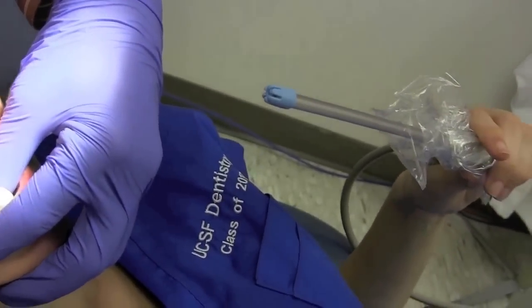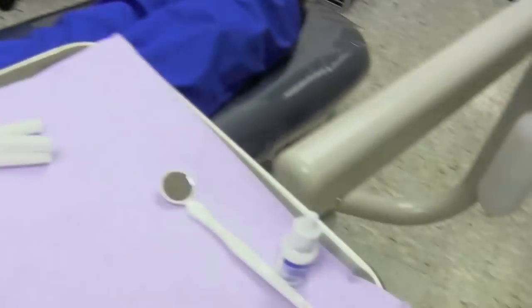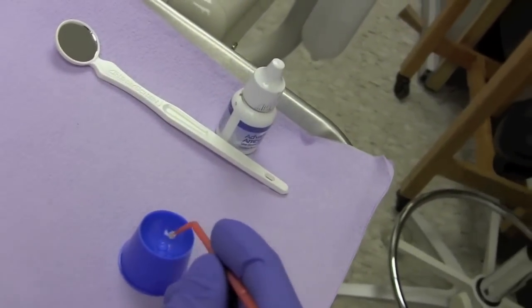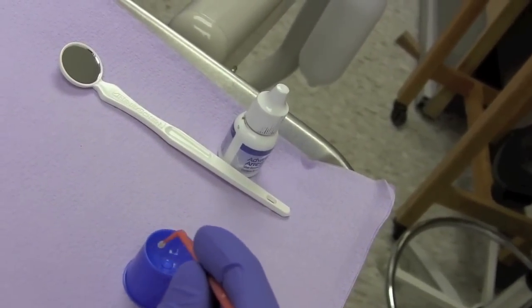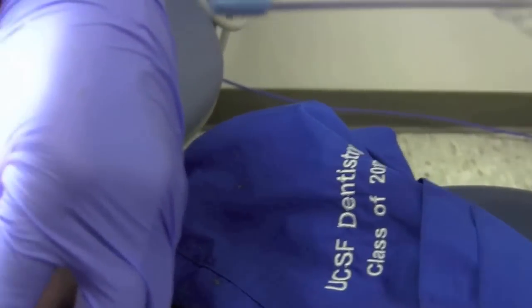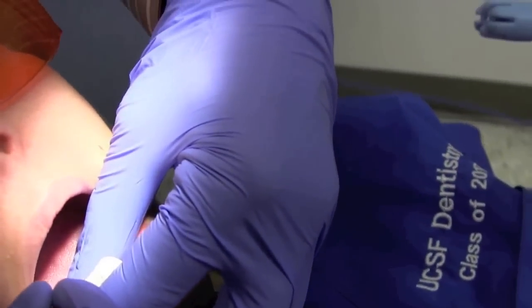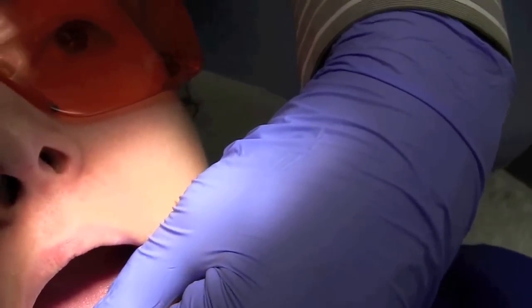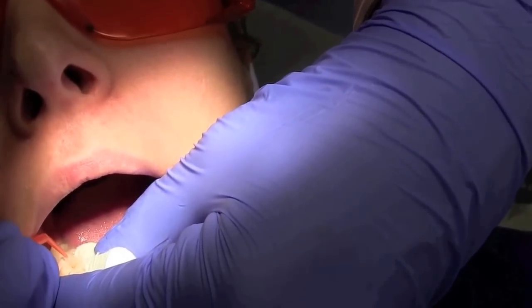I'm going to get our silver diamine fluoride. If you don't mind looking at the micro brush, we're going to remove excess on the side of the dappin dish. Bring this over to the patient. Open real big. Thank you so much. Apply to the affected area. You can see there's a little pit in the occlusal.